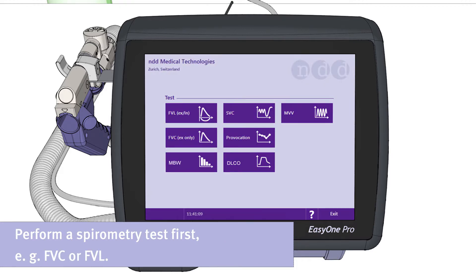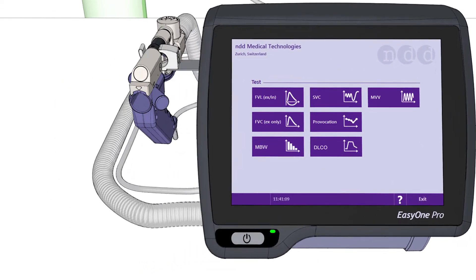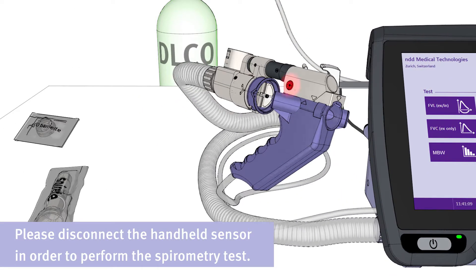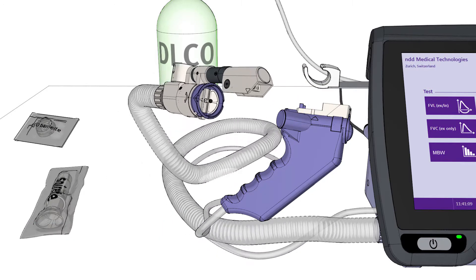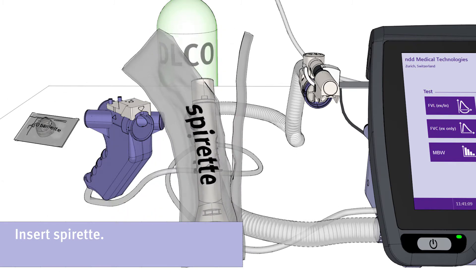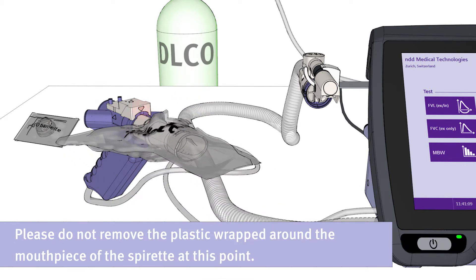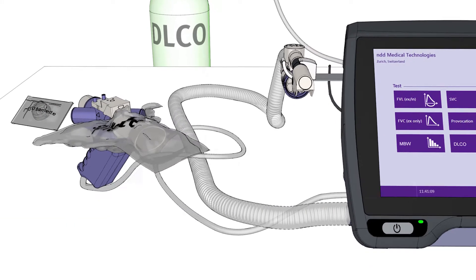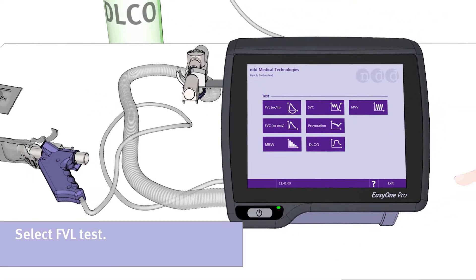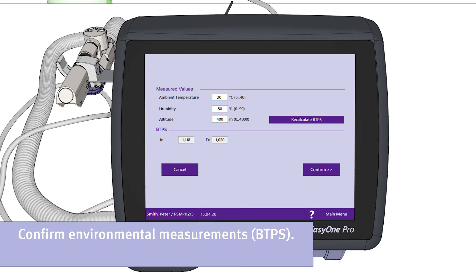To start the examination of the patient, perform a spirometry test first, for example an FVC or FVL test. In this case, we show an FVL test. Please disconnect the handheld sensor in order to perform the spirometry test. Now insert the spirette. Please do not remove the plastic wrapped around the mouthpiece of the spirette at this point. Now select the FVL test by pressing the corresponding button. Please confirm the environmental measurements.